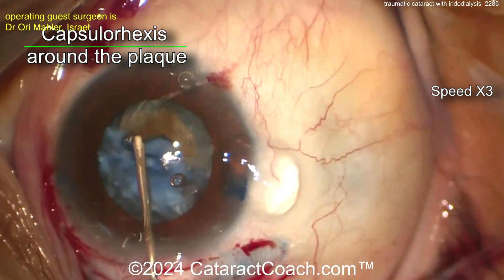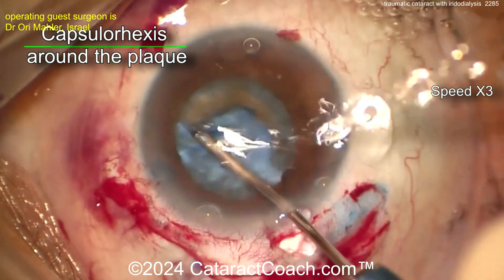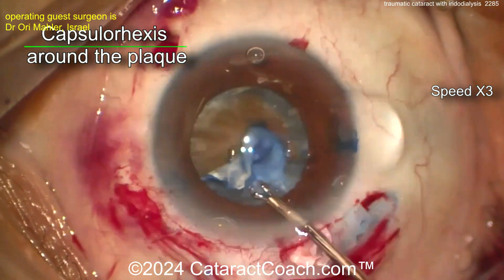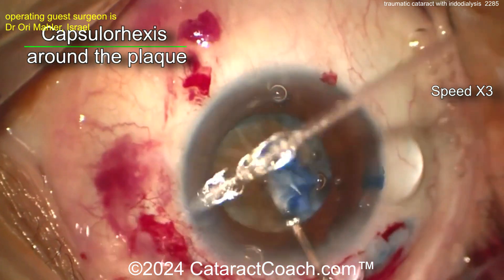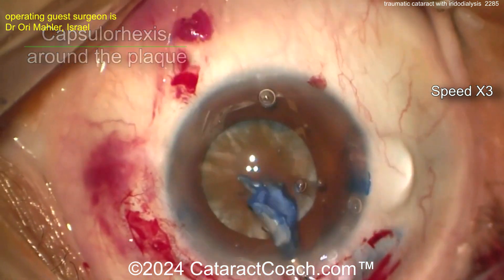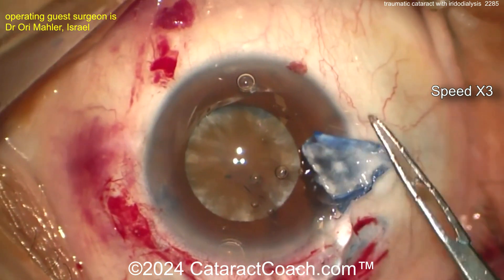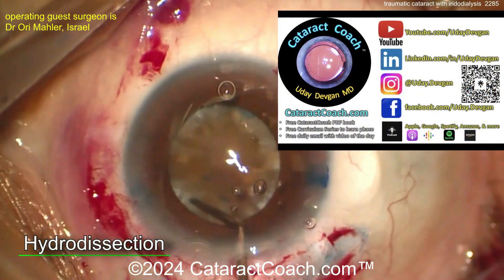You could just make the rhexis through the main incision. Getting around that plaque — that's a smart idea. A nice generous rhexis is going to be important here. Wow, that is very fibrotic — look at that. Getting the rhexis completed here; I'm watching the video for the first time with you. Nice capsulorrhexis — wow, look at that fibrotic capsule, it's crazy.